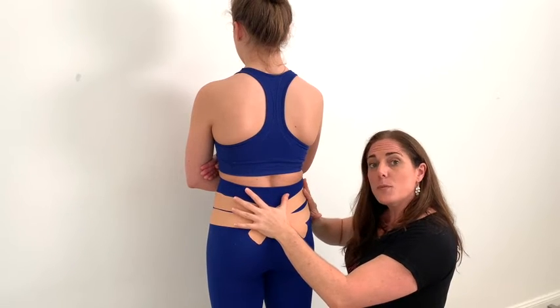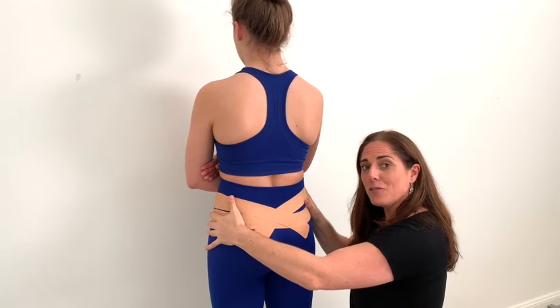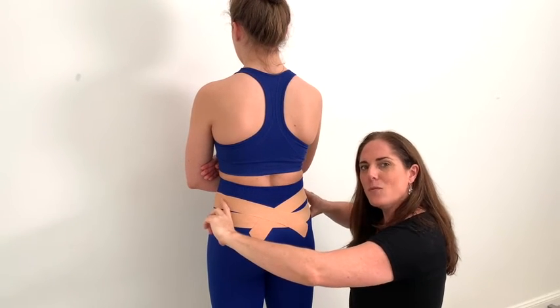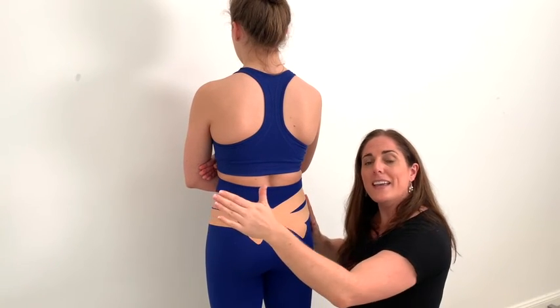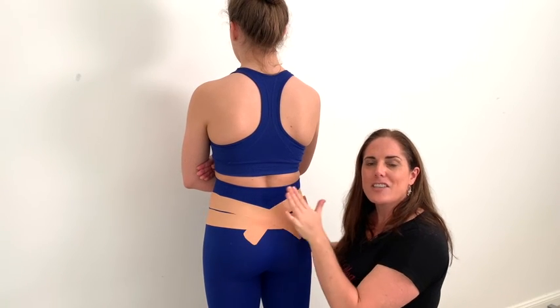If you find that this works well but your skin gets a little bit irritated with the tape, you can also try a sacral belt. Make sure that you wear it nice and low, and that it's nice and wide and elasticated, so it's a little bit more comfortable to wear for an ongoing period without any irritation of the tape on the skin.